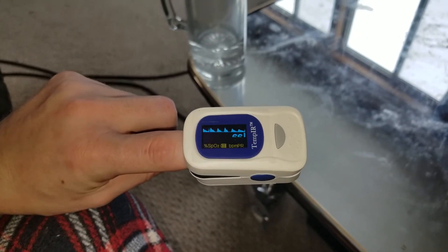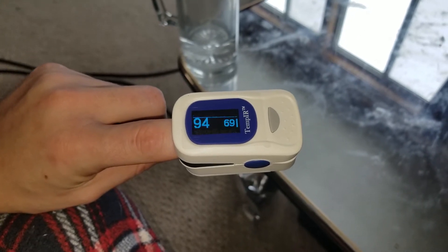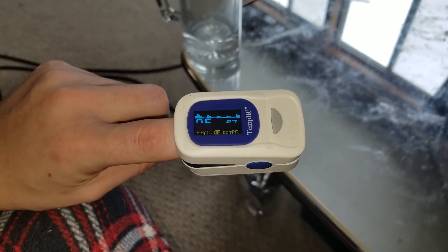I currently have a cold, so I'm not breathing very well, so it goes down. But I've found that if you start taking some deep breaths, it goes up, which is pretty cool.